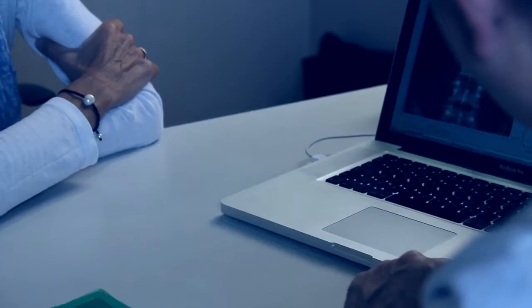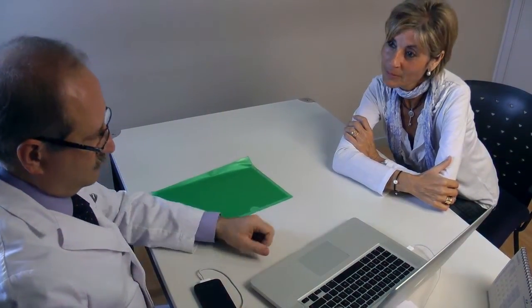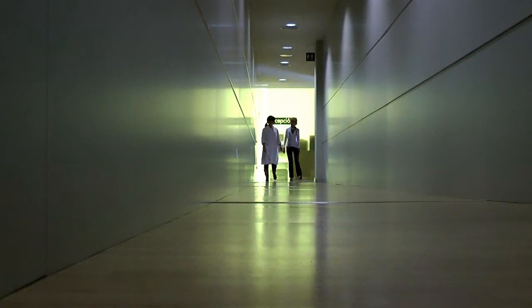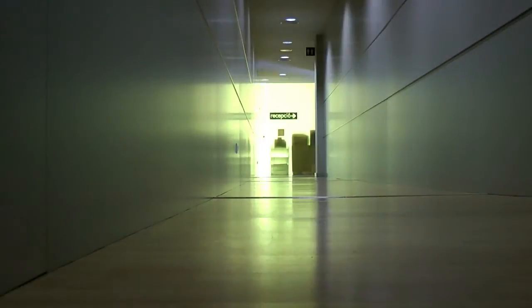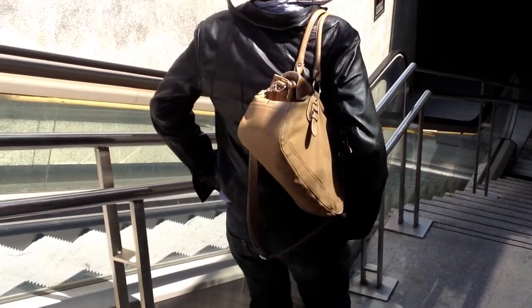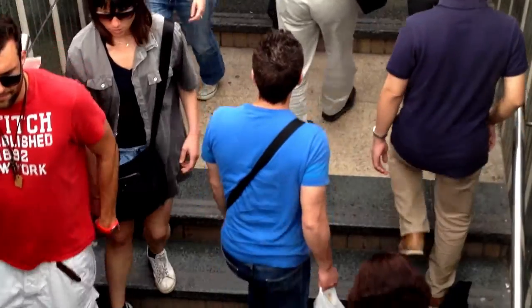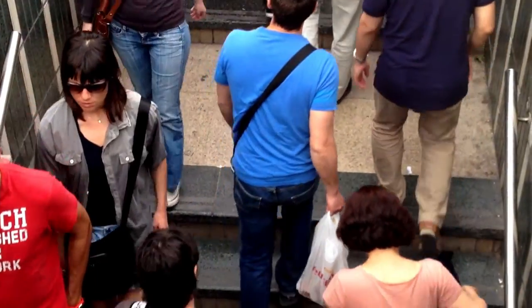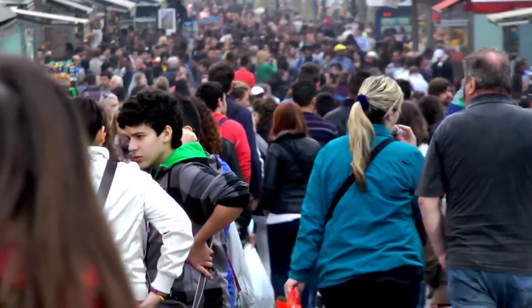My Spine will be the first patient-specific platform to predict tissue evolution during the chosen surgical treatment and subsequent rehabilitation activities. Although My Spine focuses on diseases of disc degeneration due to their prevalence, the developed prototype system will be able to analyse other spinal pathologies as well.